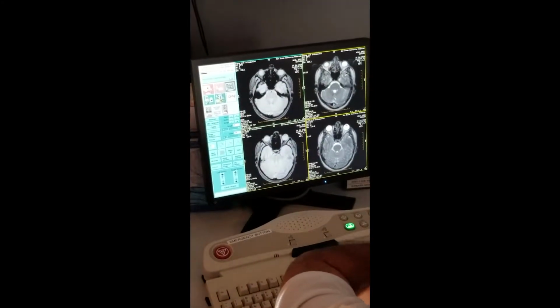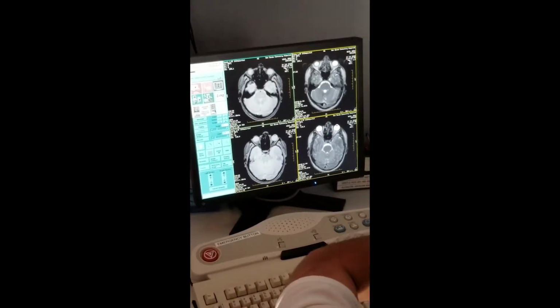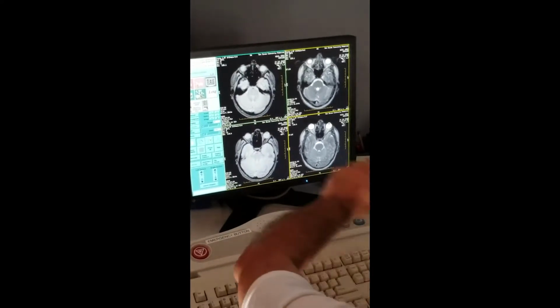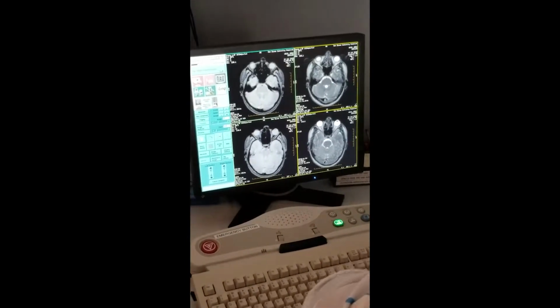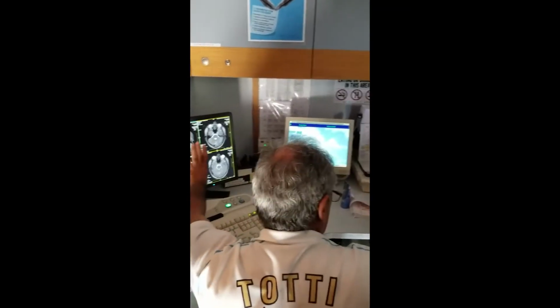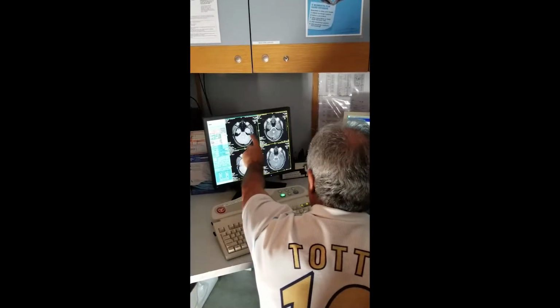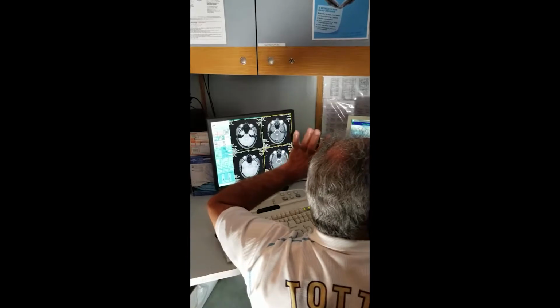Gradient echoes historically are very fast sequences. Historically, that's what you use them for when you want something done real quick. That's why TR is short, TE is short, flip angle is short. Look, how long does it take for this to come and then go back up versus this? Faster. But image quality to some extent may suffer. They call this T2 star because it's a clone of a T2. It's not a T2, but close enough.